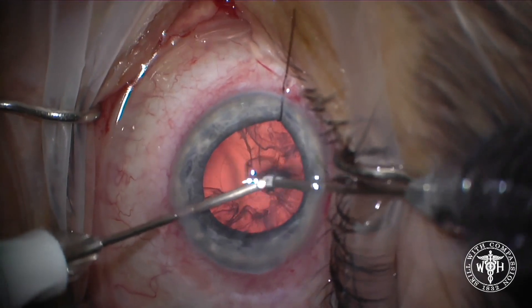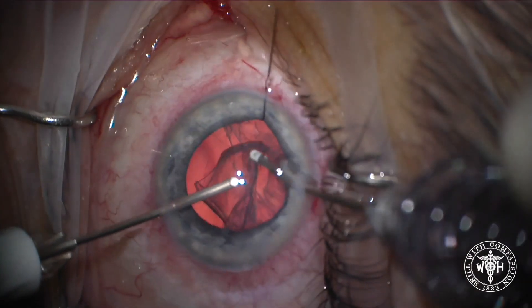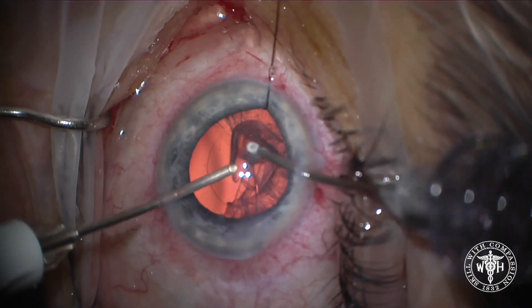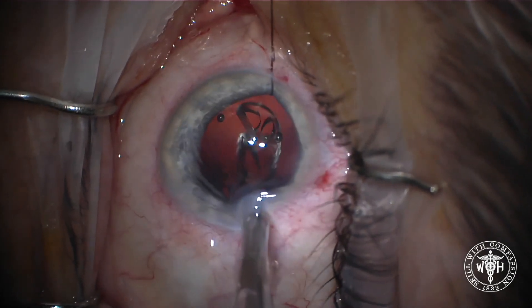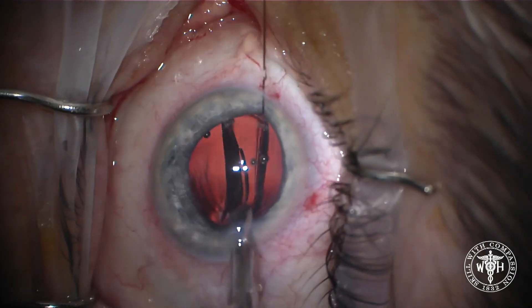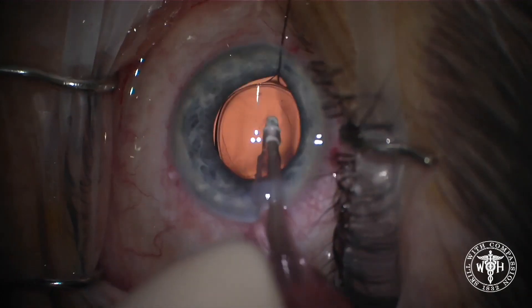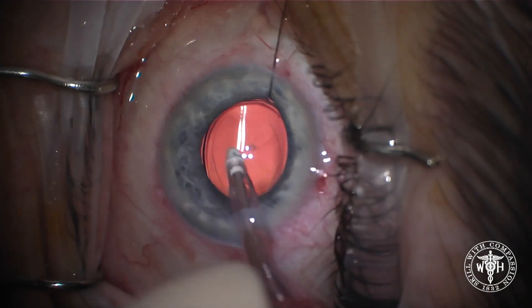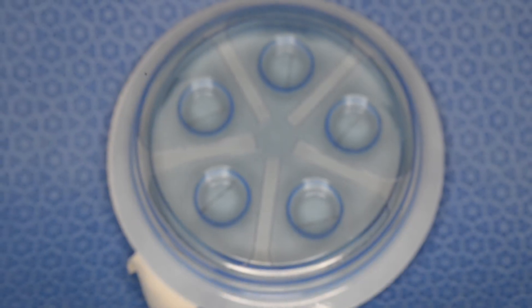Although this case was becoming more complicated because of the iris retropulsion syndrome, just placing the flexible iris hook has made this a routine case and we can get things done more efficiently in the operating room. A really cool little trick — the flexible iris retractor is not just for small pupils anymore. Here we're using it for iris retropulsion syndrome.